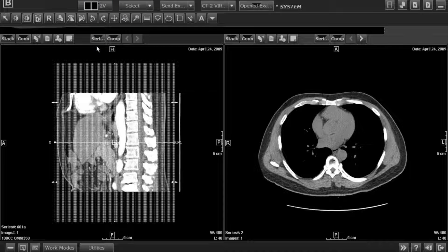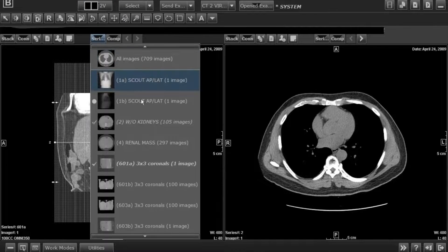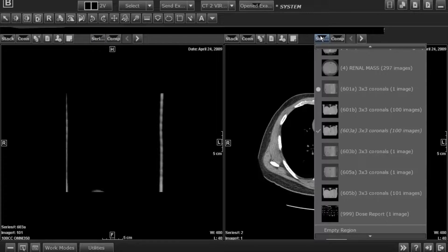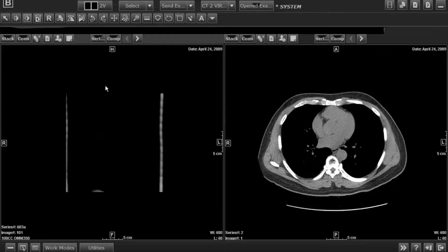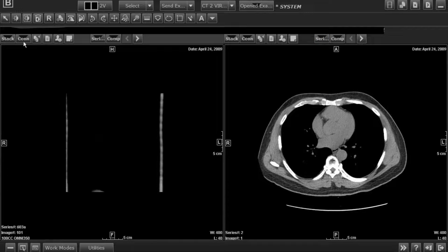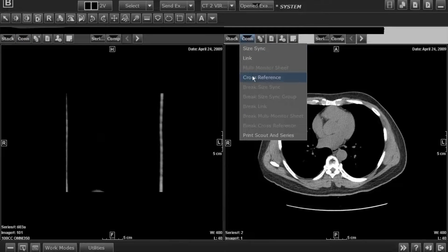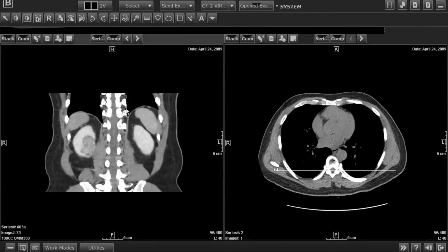Select the coronal or sagittal view on the left screen by navigating to Series, then selecting the coronal or sagittal images. Select the Axial View on the right screen by navigating to Series, then selecting the Axial Images. Click on Cross Reference to link the two images, then scroll through the images on the coronal or sagittal view to ensure the spine vertebrae are easily visible.